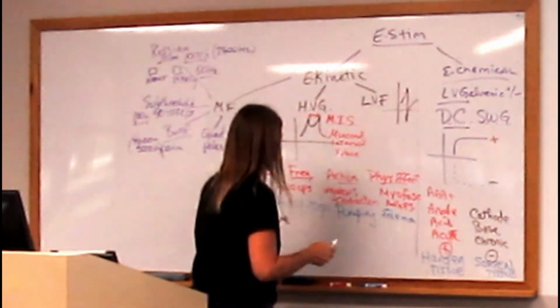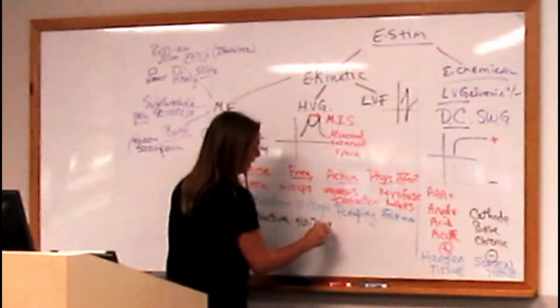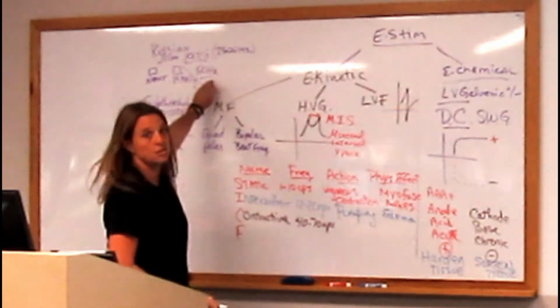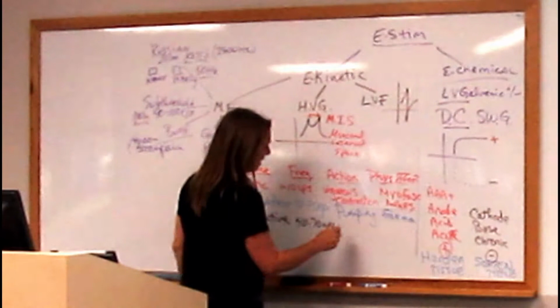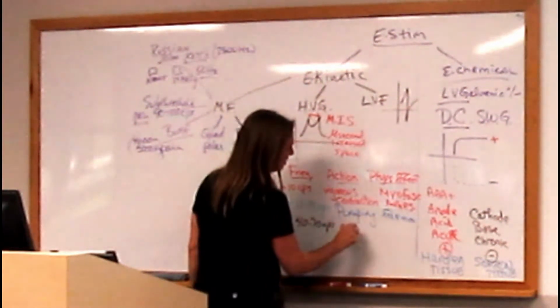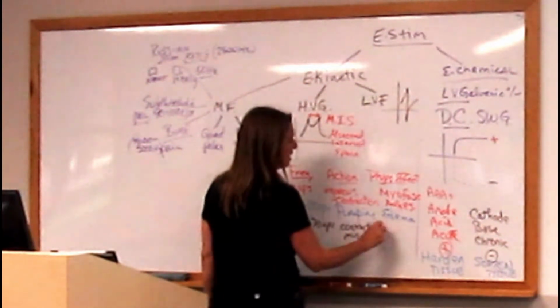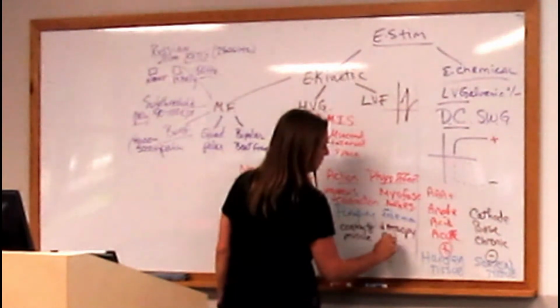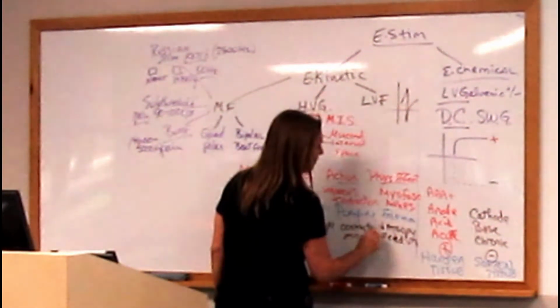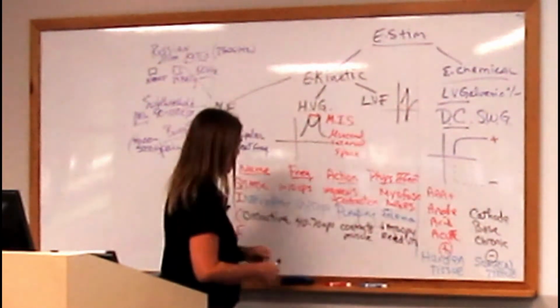The next one is going to be contractive, and when you do a contractive tetany or a contractive motor nerve stim setting, you're going to be doing it within the range of 40 to 70 cycles per second. A lot of people will go up here and just use it at 50 hertz because it goes with the Russian stim concept. And what it does is it contracts the muscle. And when are you going to do this? You know, to decrease atrophy, to re-educate muscle, and various other things. Just basically get the muscles back into their strength and to their coordination.